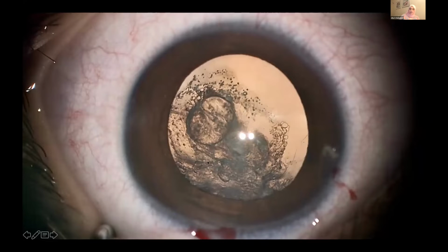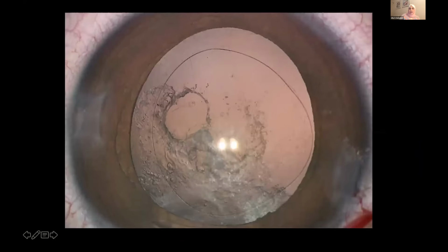Here, there's another case of small defect, but it is paracentral, and the child gave a history of intravitreal injection of Lucentis because he was a premature baby. Here you can see the defect before surgery. After irrigation aspiration, this is a paracentral defect associated with fibrosis of the posterior capsule.